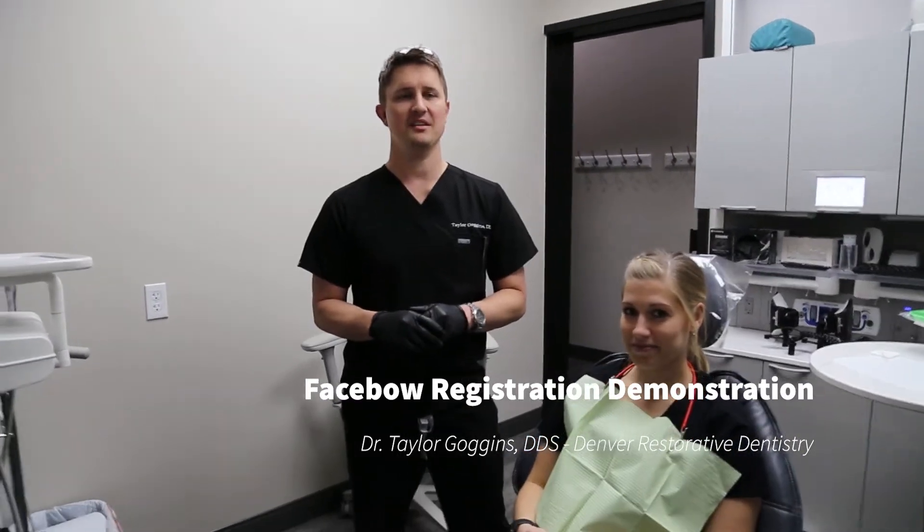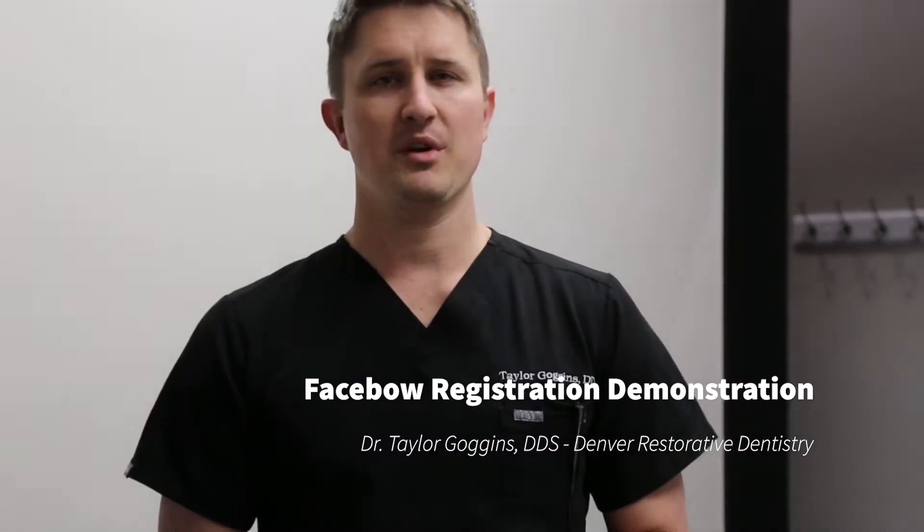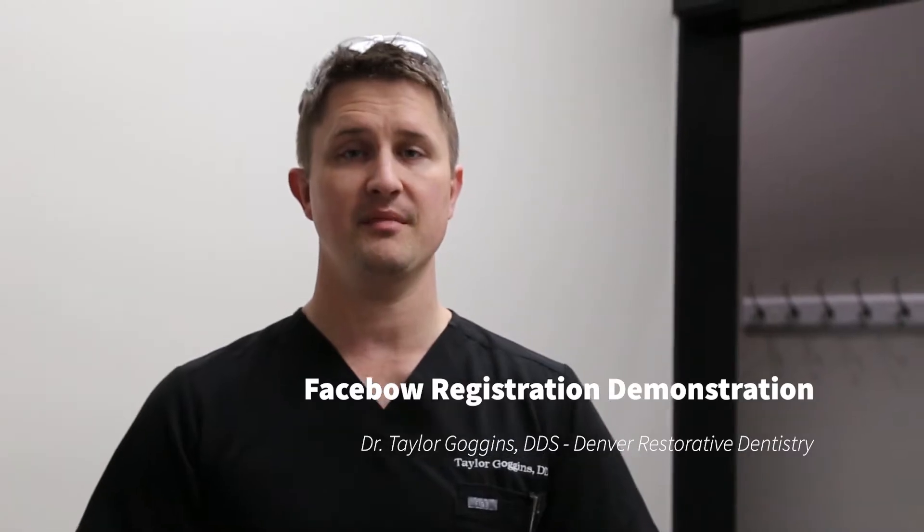My name is Taylor Goggins. I'm a prosthodontist at Denver Restorative Dentistry. Today we're going to demonstrate how to use a face bow registration using the SAM face bow.